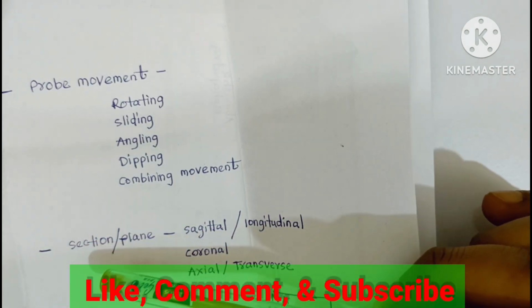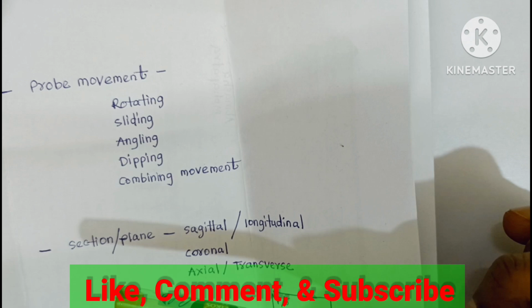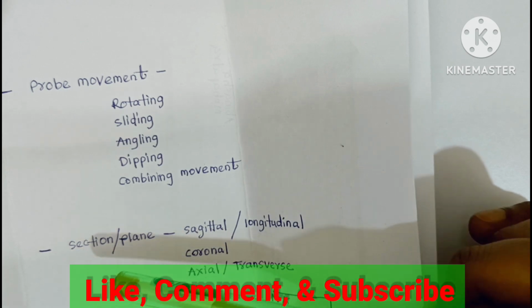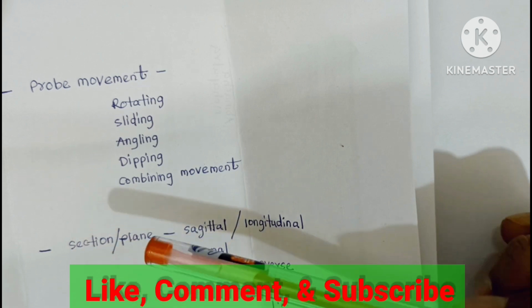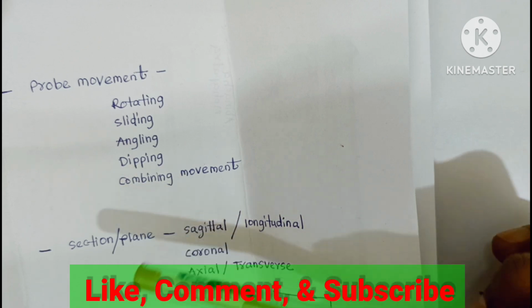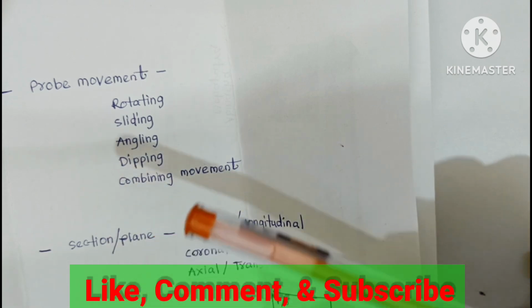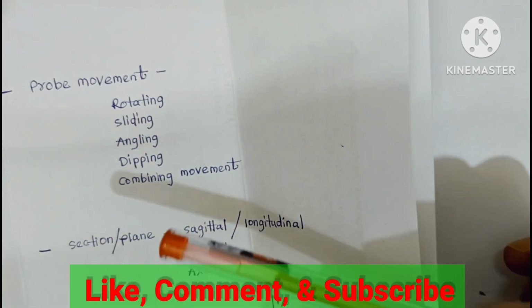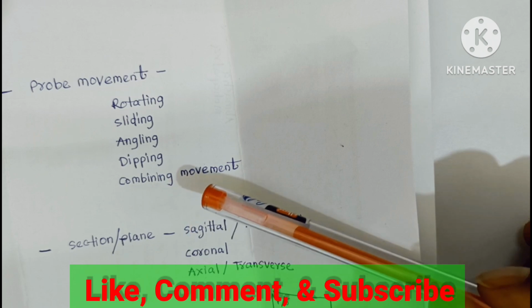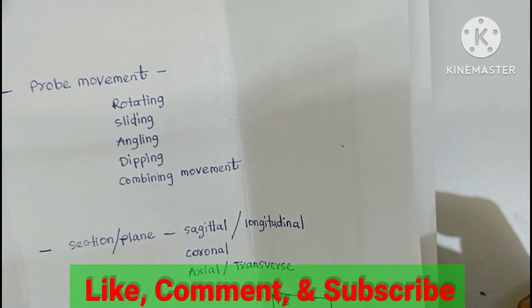After dipping, when we do sliding movement, it brings the target to a horizontal plane. Angling is also followed by sliding. By doing this, we can accurately assess and measure a targeted structure. Remember, dipping is along the narrow axis and angling is along the broad axis. Dipping is followed by sliding and angling is also followed by sliding. Combination means a mixture of different types of movements; the above movements together are called combining movement. Thank you.